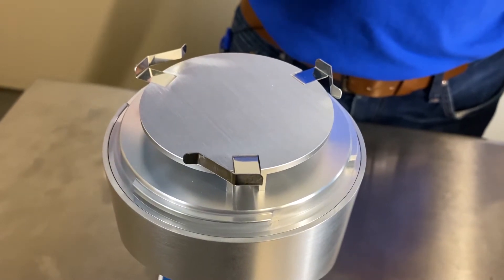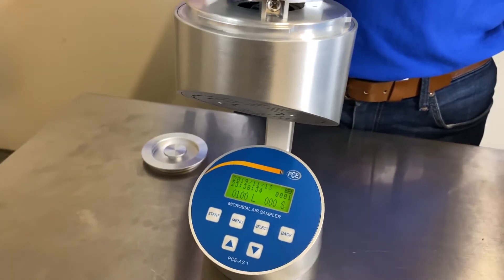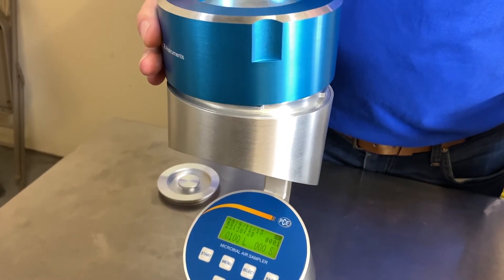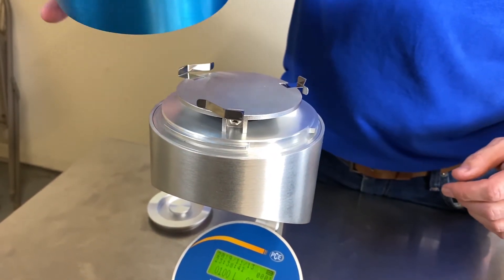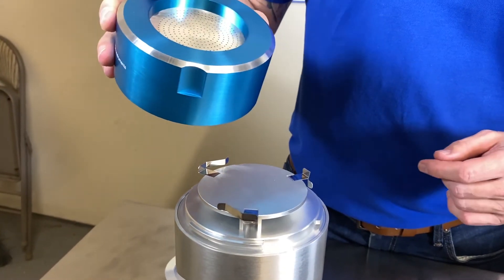And that would be in accordance with USP 797 and CAG 009. And then after you're finished, you would put this equipment into an autoclave for about 30 minutes to sterilize it. Or you could also wipe it down with 75% alcohol.